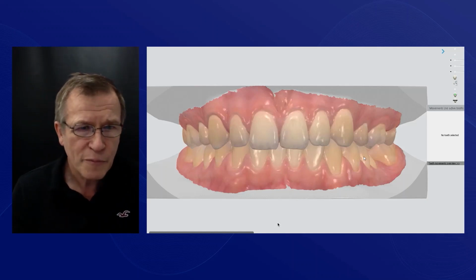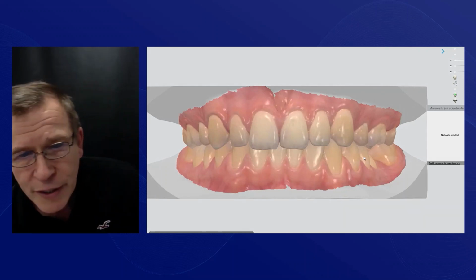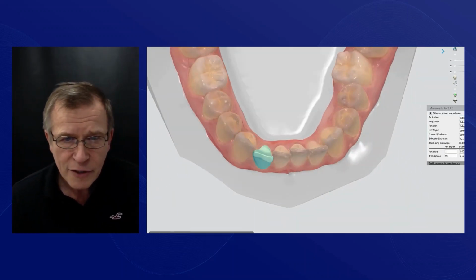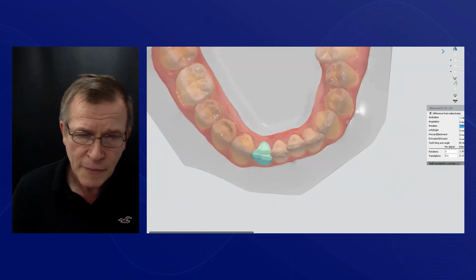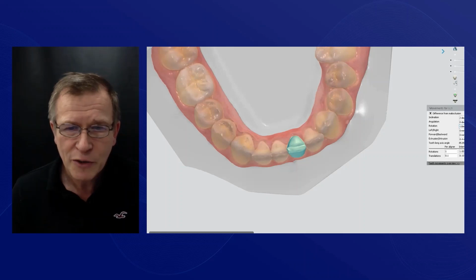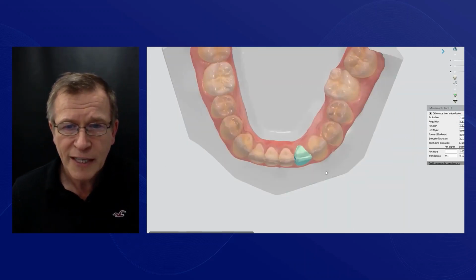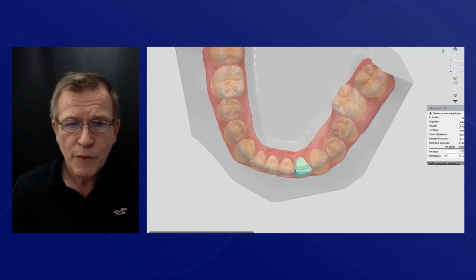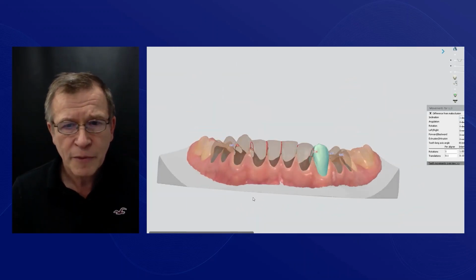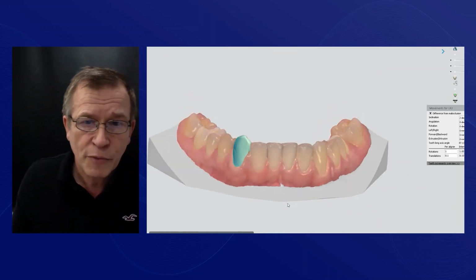So now things have moved on considerably. Now we can not just scan the patients, but we can start to do a little bit of orthodontics ourselves if we like. So we can use systems. This is, again, apologies for it being mainly 3Shape, but other systems are out there. But this is the ortho analyzer system, the clear aligner system. But these little anterior alignment cases, we can scan them. We can use this software or get the lab to do it for us, if that's a more appropriate thing.